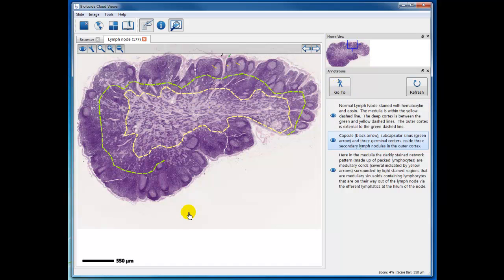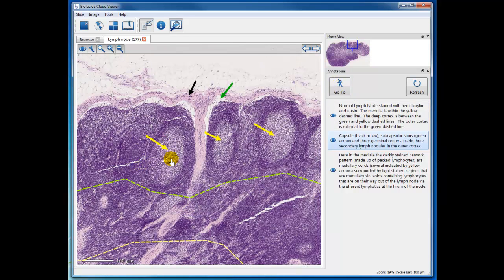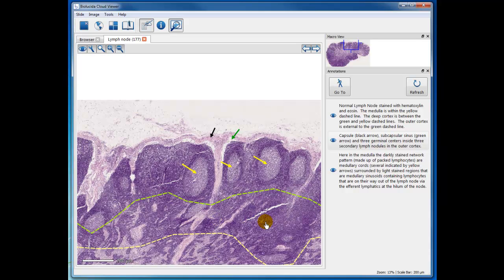So if we look at this next annotation, you will see the cortex with the germinal centers, and all these would be B lymphoblasts, because these nodules are pretty much pure B lymphocytes, and they are being expanded in population by mitosis of similarly programmed B lymphocytes, which will transform into plasma cells that will finally make their way into the medullary cords and throughout the body.